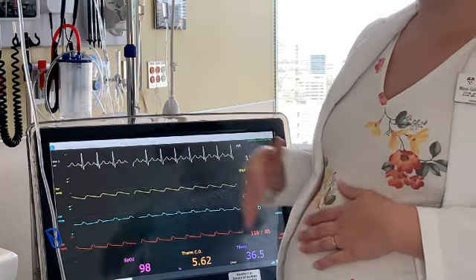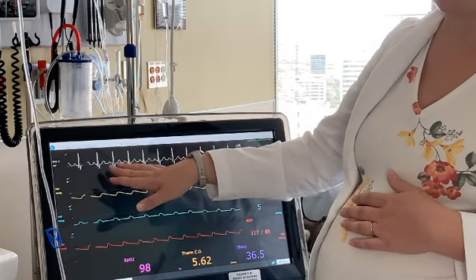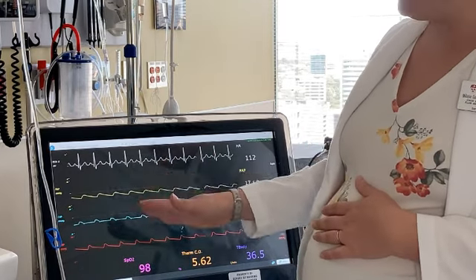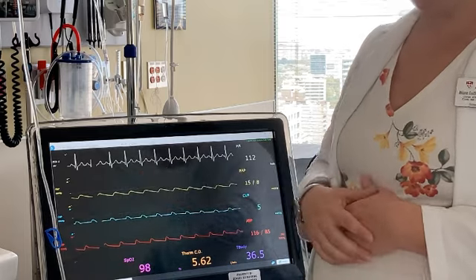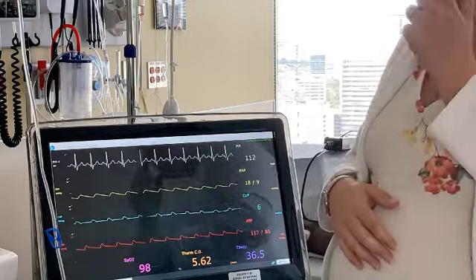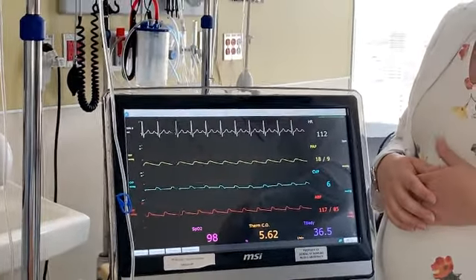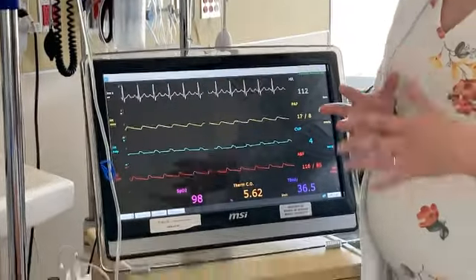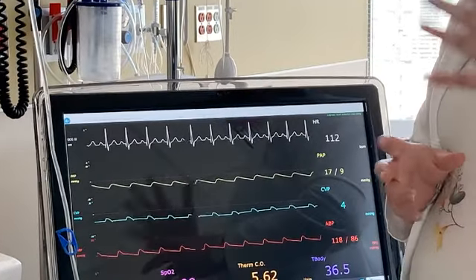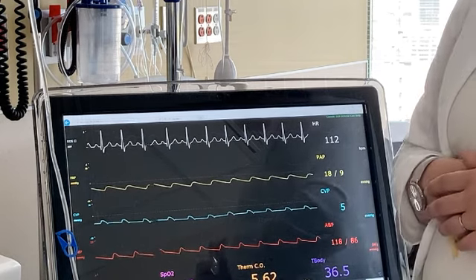If you remember, the electrical image that comes up always happens before the mechanical capture. So generally speaking, if we're towards the middle of the QRS complex, it means it's right before systole, just before we mechanically have it happening. That's where the valve is open, but it's filled with blood, and it's just about to close in order to go into systole and expel into the pulmonary artery.